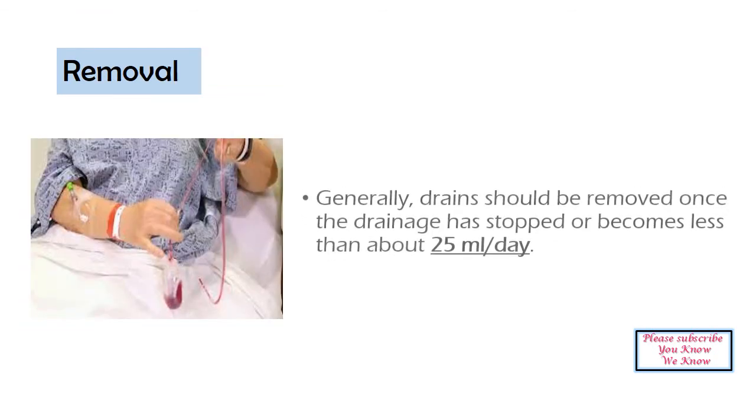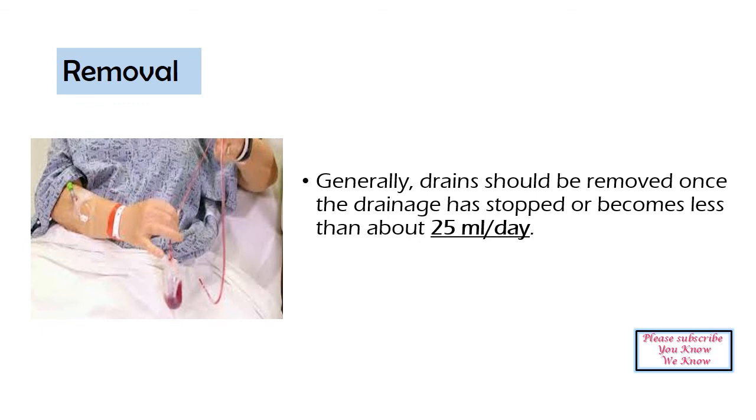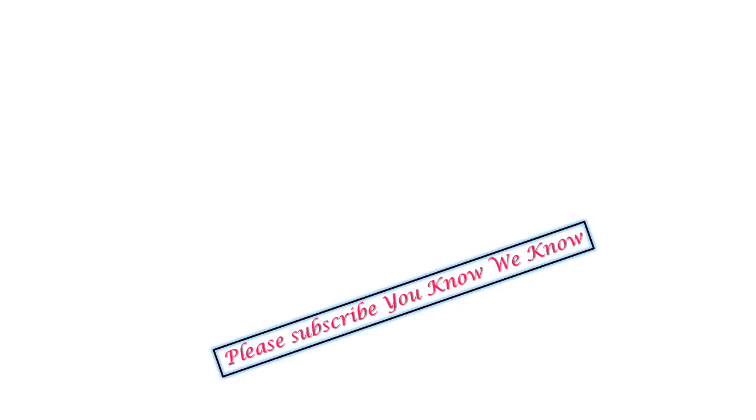Removal of the drain tube: generally, drains should be removed once the drainage has stopped or become less than about 25 ml per day. So we have discussed drain care.